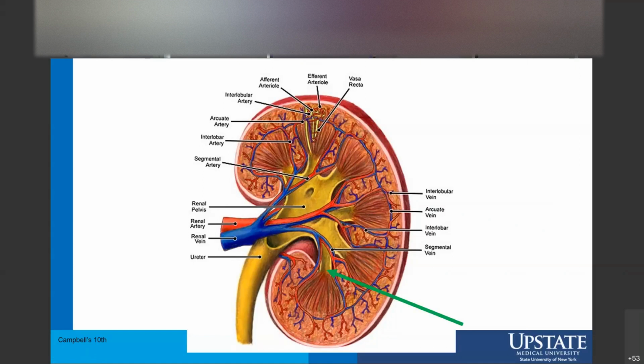And what happens is you go right through that artery when you dilate, crack the artery, you get bleeding, and you're having to make a 90-degree turn just to get to your stone. Perhaps a better course of action would be to position your needle here, and that's a little bit more of a straight shot. What does that look like clinically?